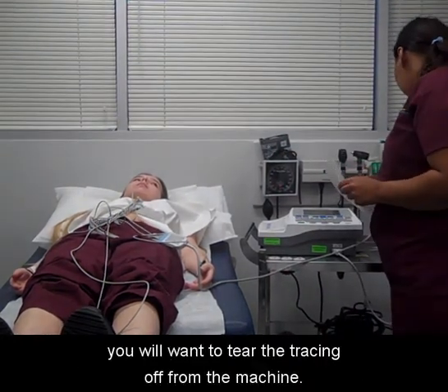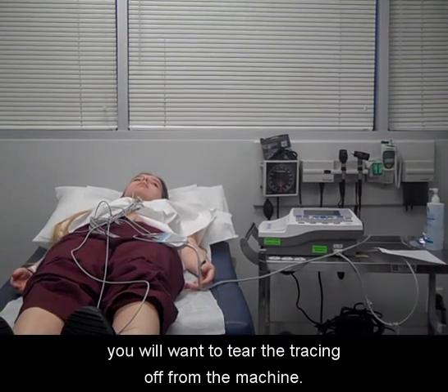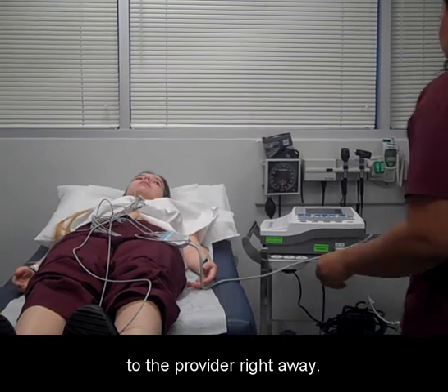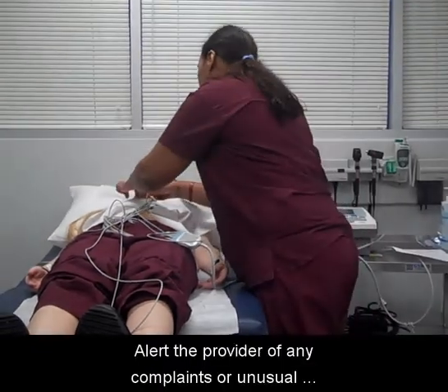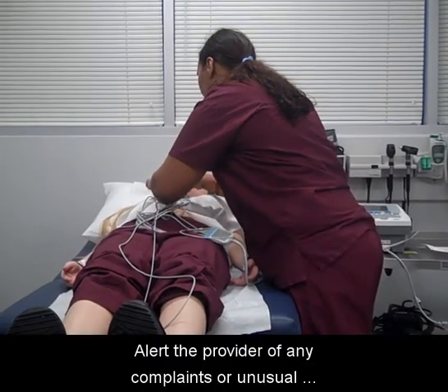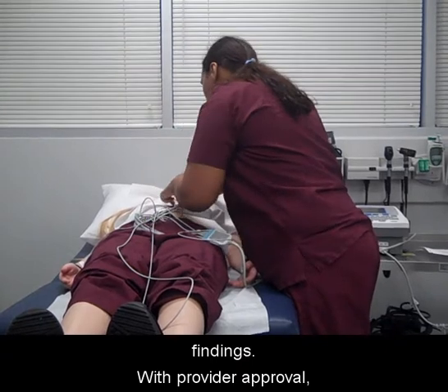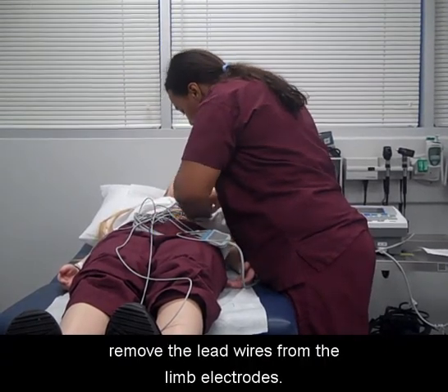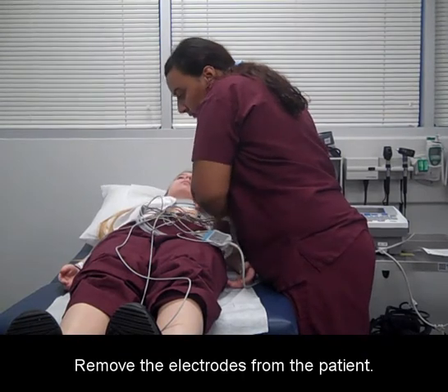For some, you will want to tear the tracing off from the machine. Others, it may electronically be sent to the provider right away. Alert the provider of any complaints or unusual findings. With provider approval, remove the lead wires from the limb electrodes. Remove the electrodes from the patient.